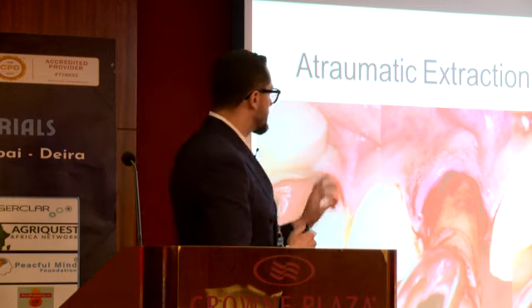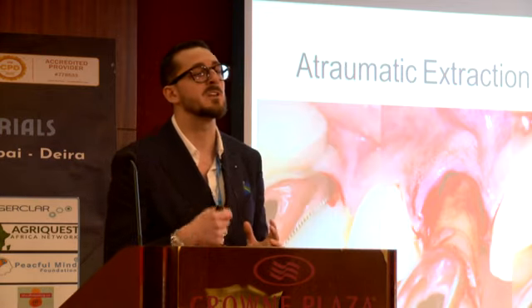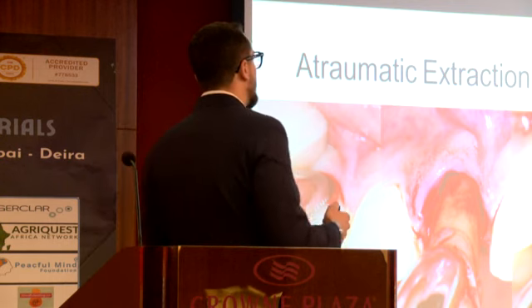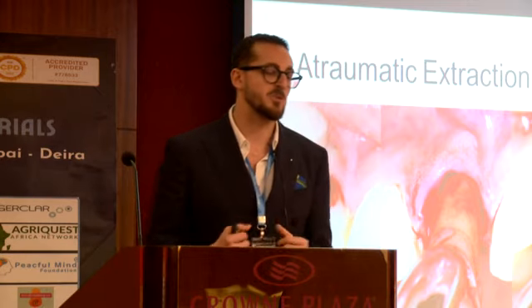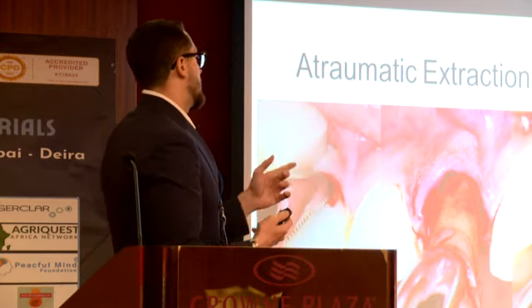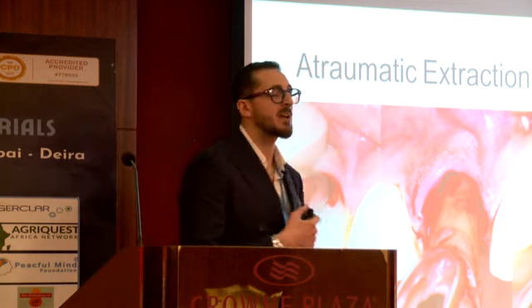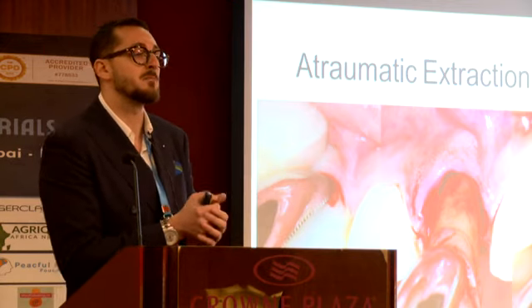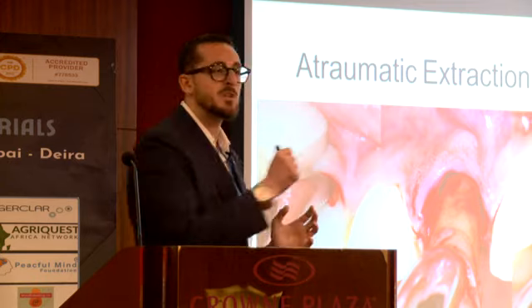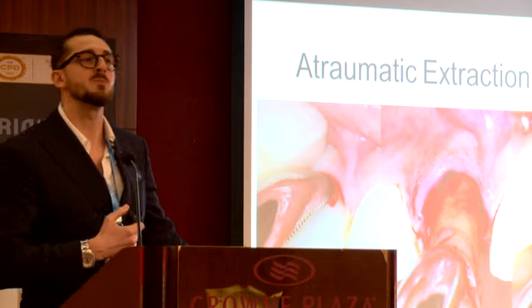Once you have the tooth out, you first have to debride the granulation tissue and stimulate bleeding of the socket in order to start the healing of the socket. And then with the probe, I check the integrity of the palatal, interproximal, and buccal plates. Why check the buccal plate again, if I have a CBCT? Because in the CBCT, sometimes you cannot have a proper diagnosis of fenestrations or dehiscences that are so tiny, and so with the probe you check the integrity and confirm that you can go on with the trimodal approach and you don't need a GBR procedure.